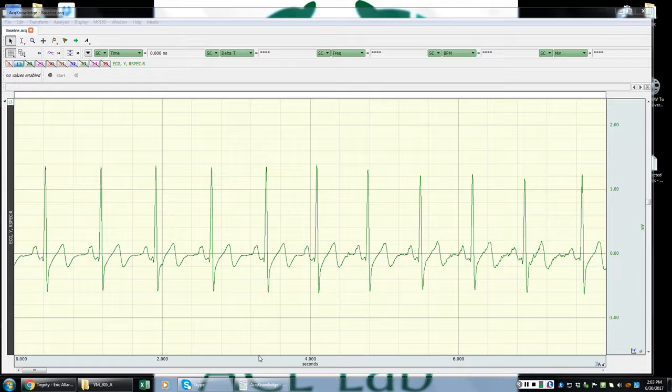or any other variety of reasons, or it could be due to just individual differences in heart rhythm for certain folks. Like, from some of our older adults, there's certain arrhythmias that can pop up, or there can be a drop off in signal that we have to basically extrapolate where an R peak should be located in those types of instances. All right, so this is actually a signal that we deliberately tried to create some artifacts in.